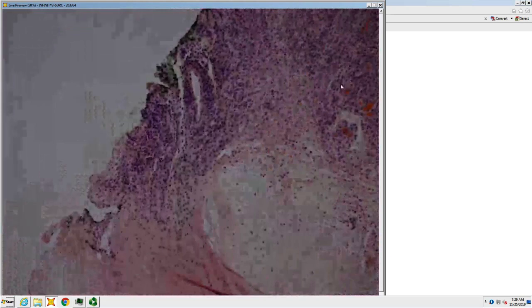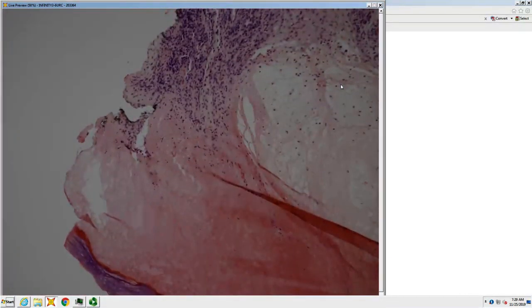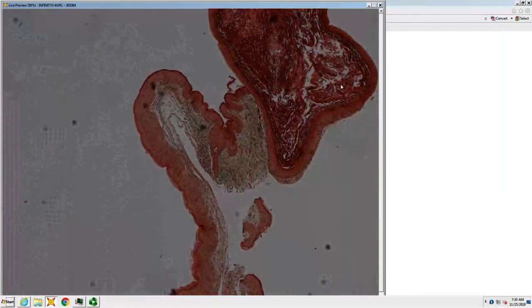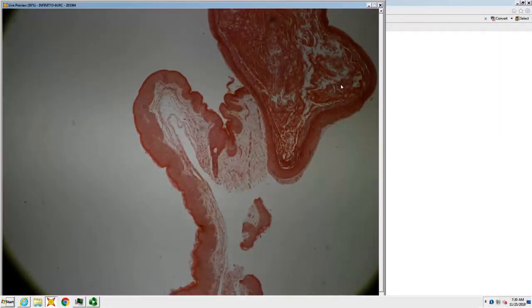Like a pox, like parapox ORF group, which is exactly what that is. So granulation tissue, elongation of the rete, and then cytoplasmic eosinophilic inclusion. True pox tend to have both nuclear and cytoplasmic. Parapox, you often just see cytoplasmic.